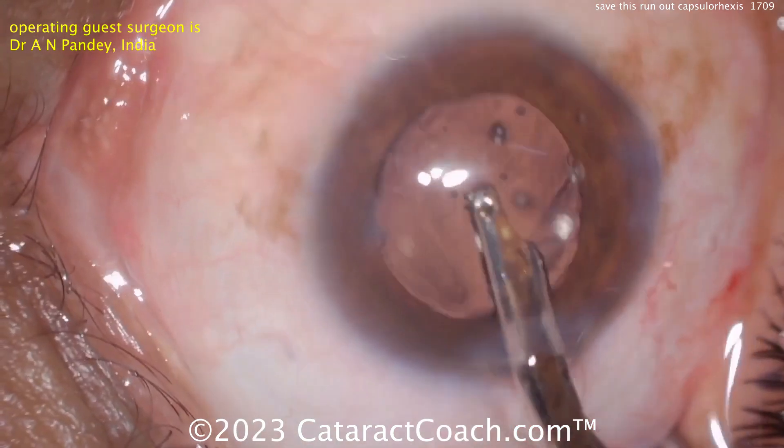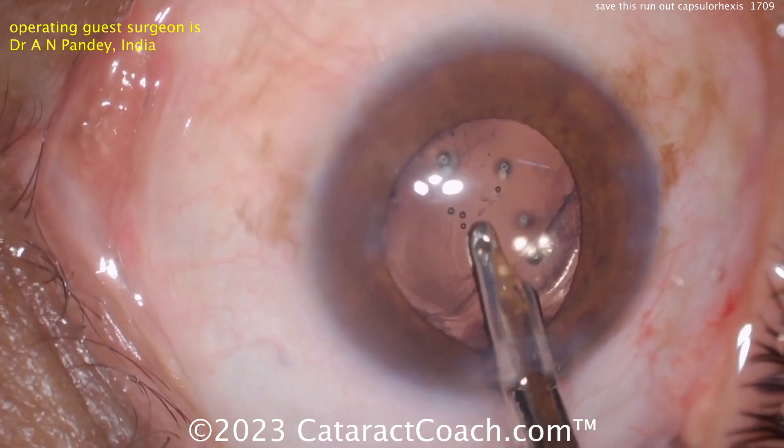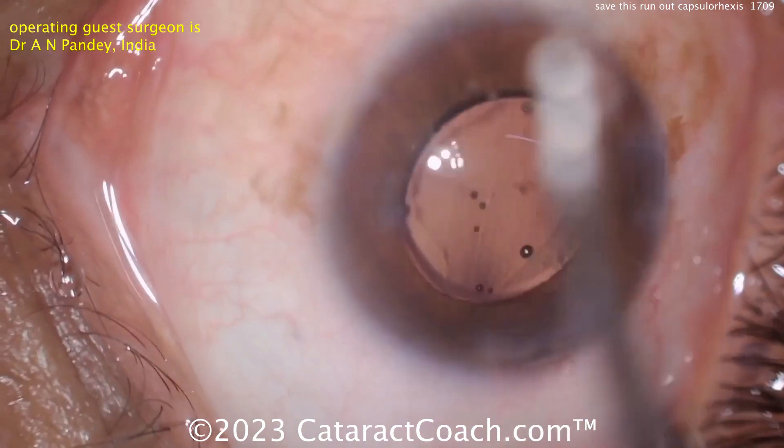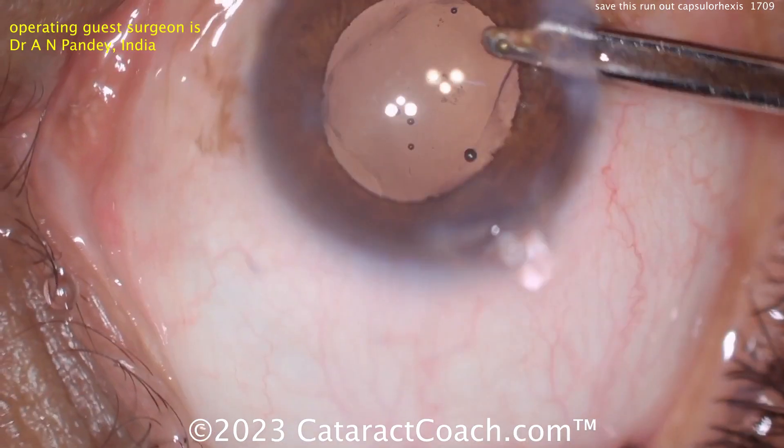When you rotate it like this it kind of disappears — I'd rotate it so that the haptics are 90 degrees away from that one irregular area. I wouldn't leave a haptic in that area. Tough case, but it all worked out fine in the end. I'm sure the patient was very pleased with this outcome — it's a good learning case for all of us.